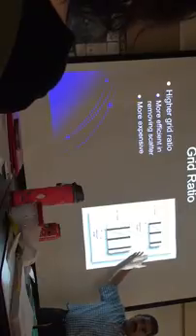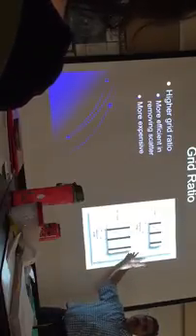So they are expensive. You're talking, a cheap grid is probably about $900. They are expensive, okay? And the higher the ratio and the higher something else, we're going to look at in a second, the higher the frequency, the more expensive they become, okay? So that's so you know. All right, higher patient exposure.